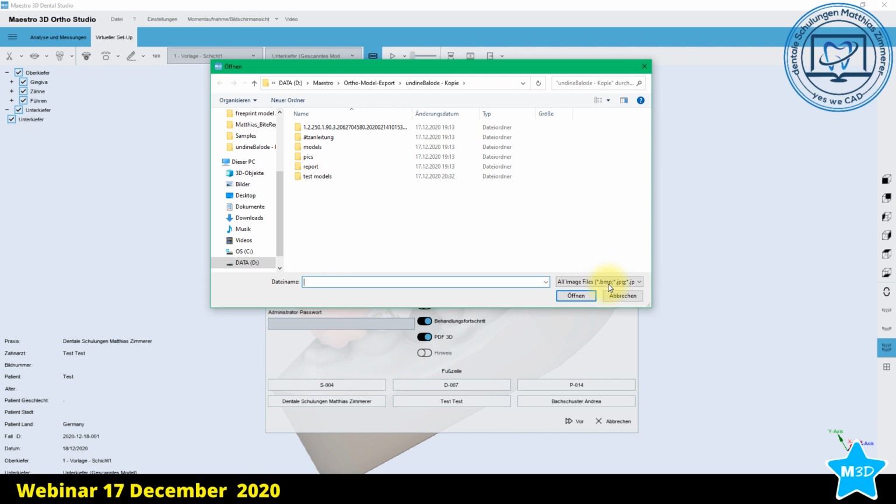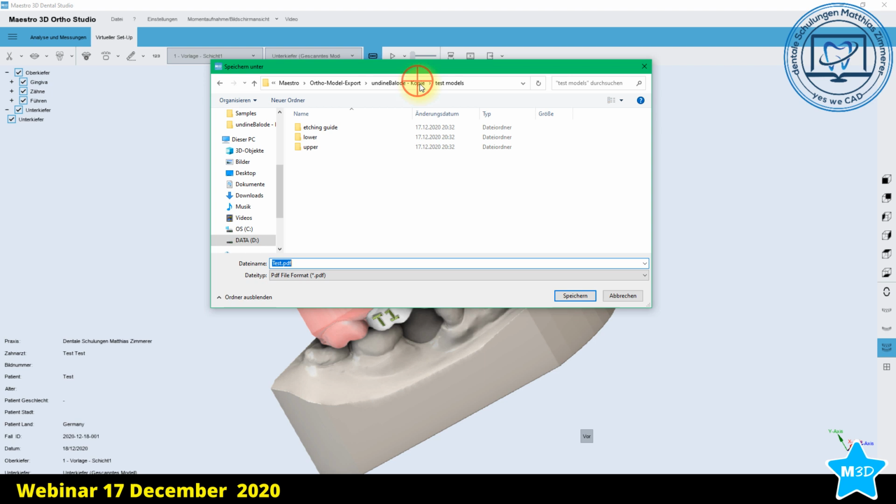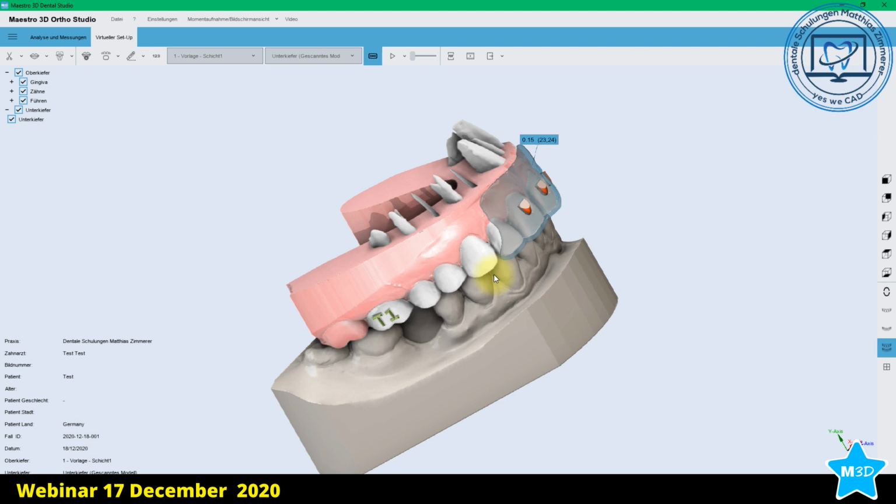At the last, we would get the report. You can adjust the report like you want. You can put in what you want. You can make the colors of it. You can have your logo on it. You can name it like you want. You can zip it. You can close it with a password. Just set up your export, and the software will tell you it's exported.